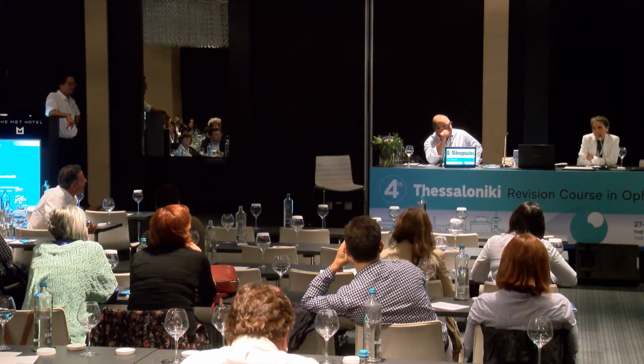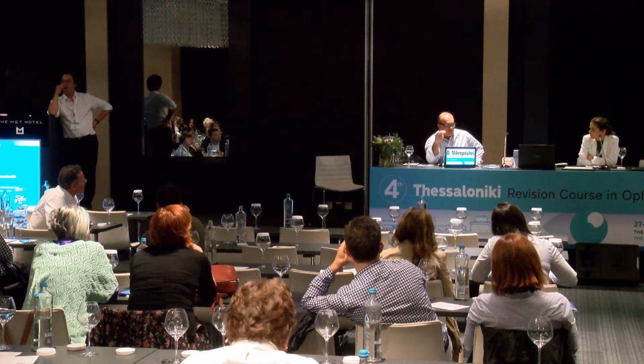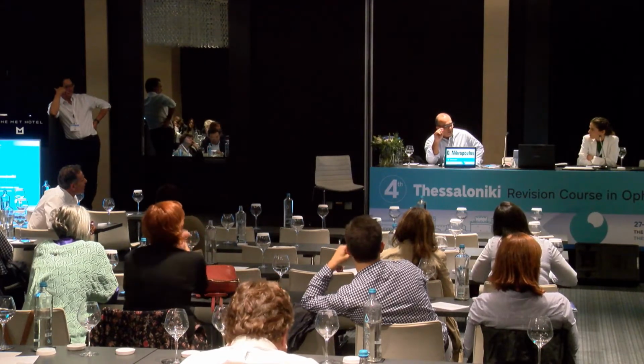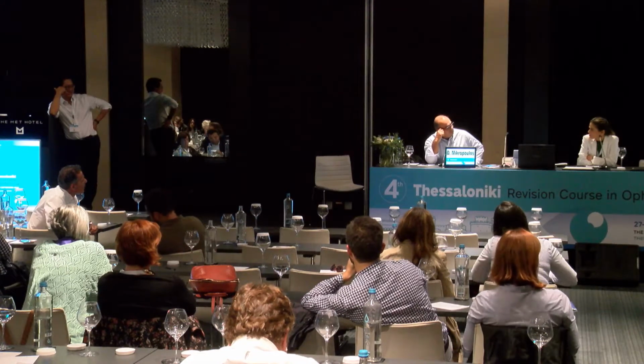I personally think I know the limitation of OCT. We have the floor effect. We cannot monitor the patient with advanced glaucoma. But do we really need to monitor these patients? I mean that the target IOP should be the lower the better. So what will be your choice?